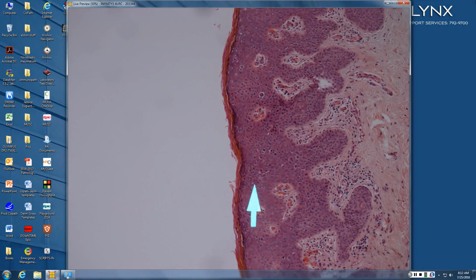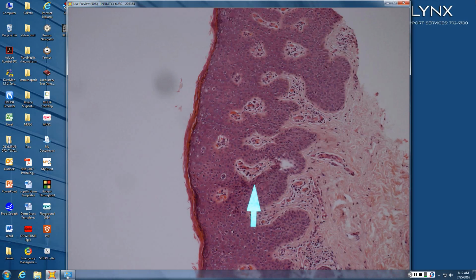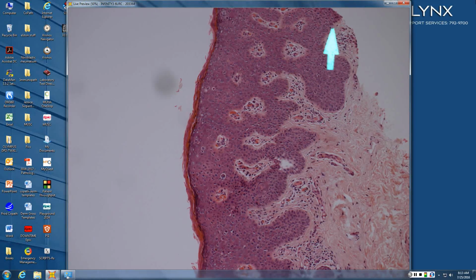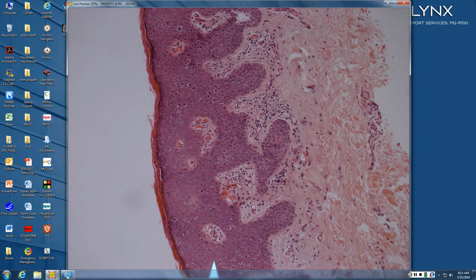Okay, so Nicole, why don't you help us with this one? So automatically, there's too much atypia. All the cells look too jumbled. I can already see mitoses that are way too high in the epidermis, so I'm thinking Bowens. So you're thinking Bowens. But is it full thickness atypia, or is the atypia kind of just scattered? It's kind of just scattered. And the clinician says, Bowens? And this person just had lots of bumps in the genitalia. Oh, then it's Bowenoid papulosis.